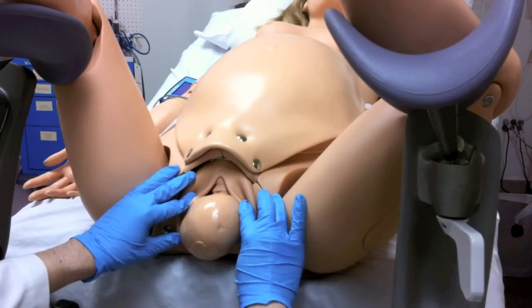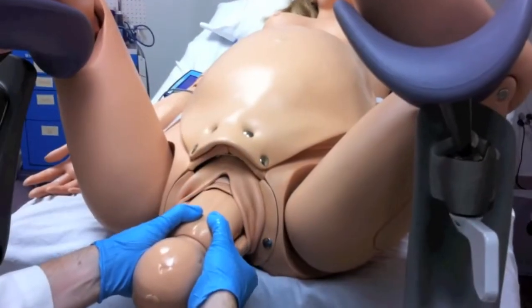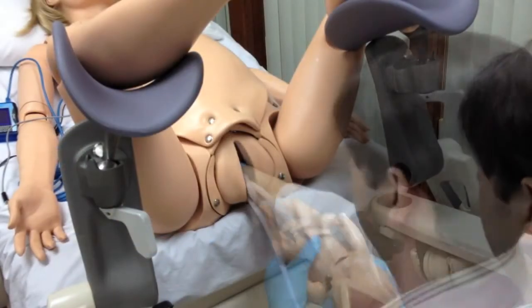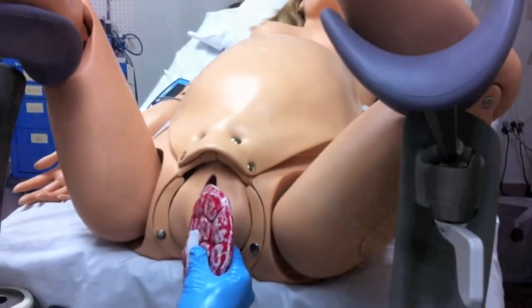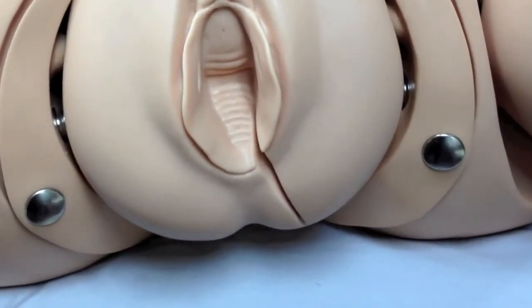During delivery, the fetus begins in ROA position and rotates while moving down. When shoulders are completely delivered, the motor turns off. The students should then remove the fetus from NOEL in a normal fashion and proceed to birth the placenta. The umbilical cord can be clamped and cut. Students can also practice episiotomy repair.